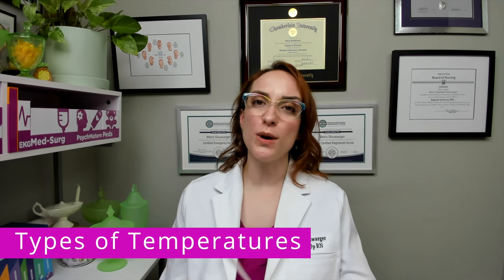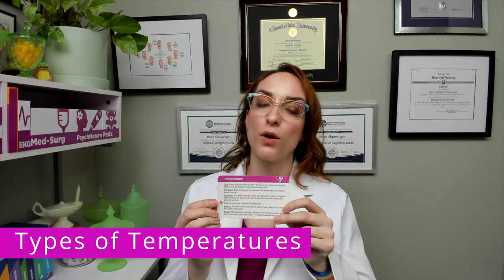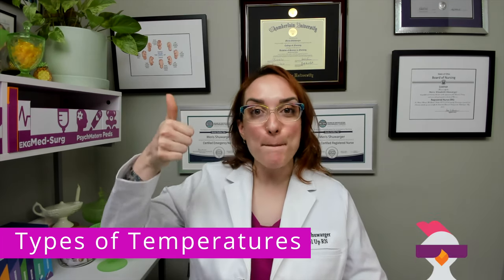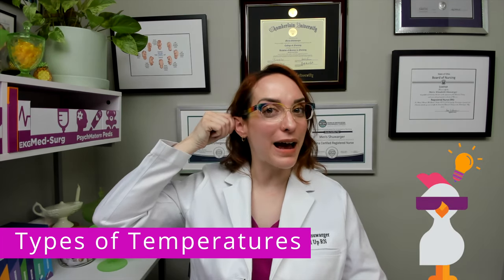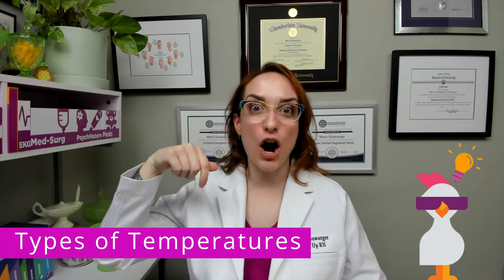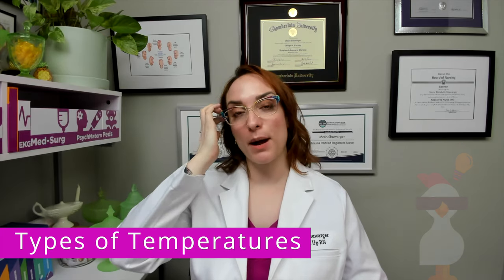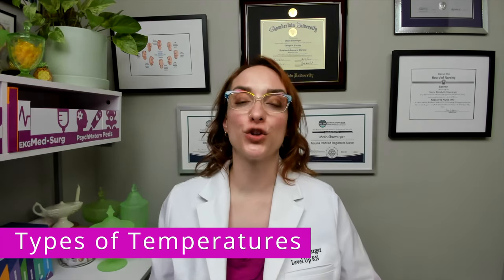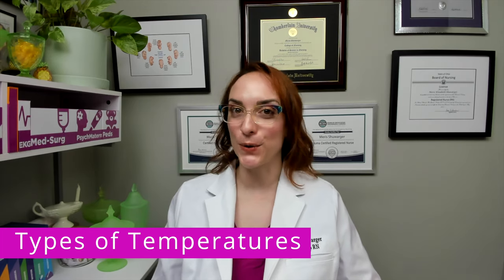Here's a cool chicken hint to help you remember: adults are up high, so up and back; children are down low. Just remember this applies specifically to children less than three years old.